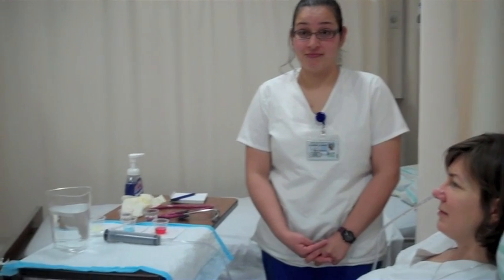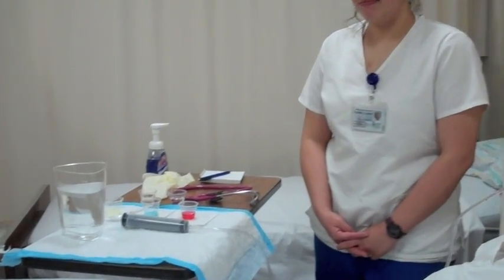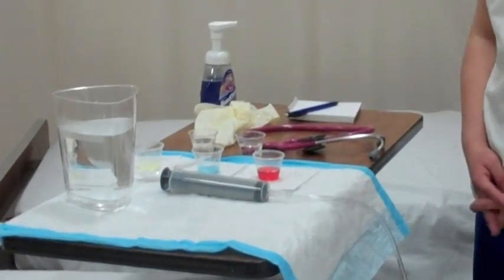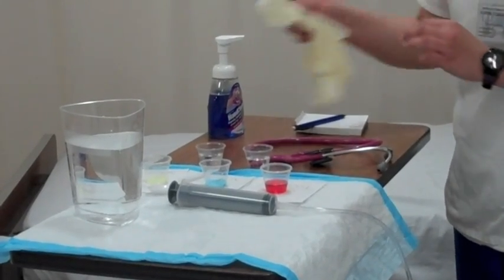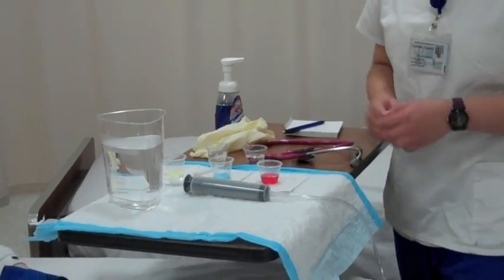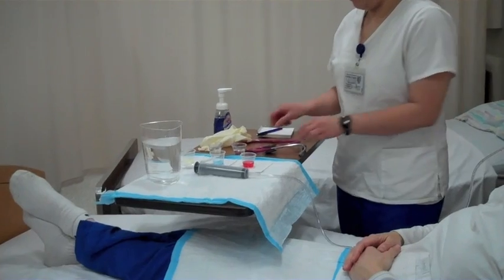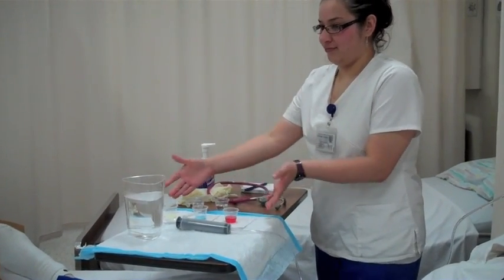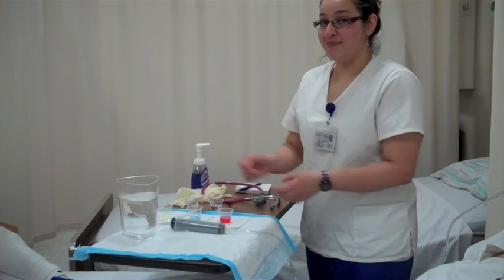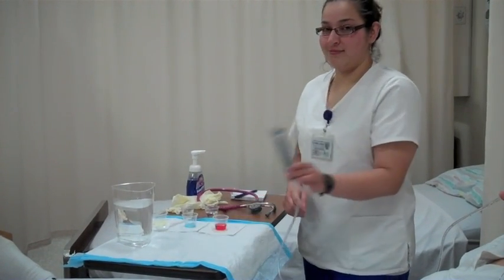Step 1. The first step is gathering supplies. You will need gloves, water, which does not have to be sterile, a stethoscope, medication cups, medications, and a 60 milliliter syringe.